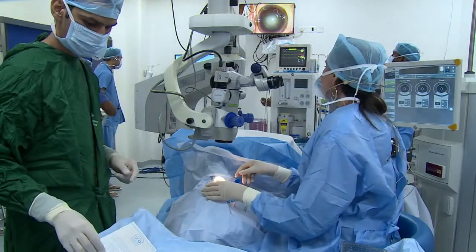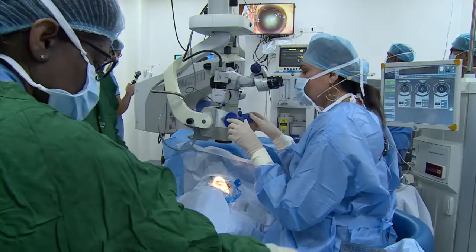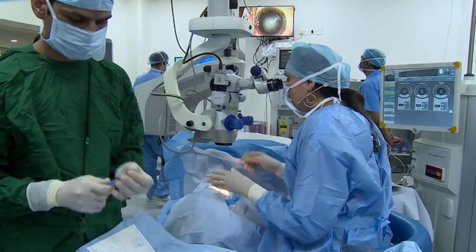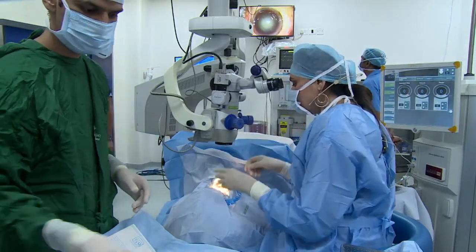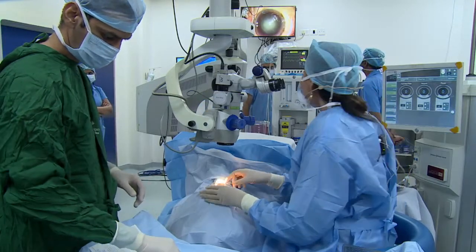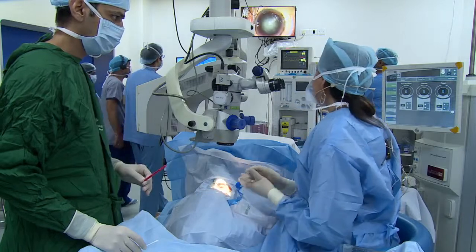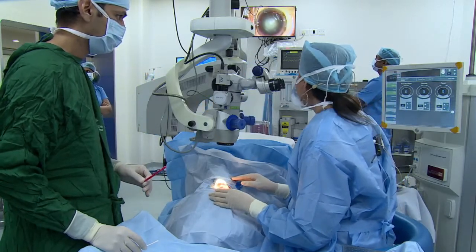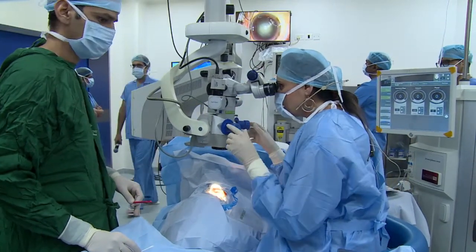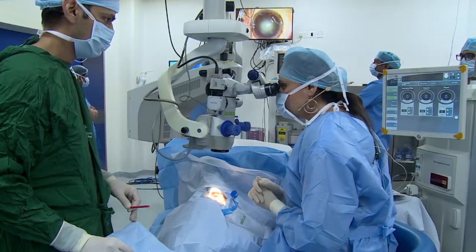Yes ma'am, good afternoon ma'am, can you hear me? Good afternoon everybody and welcome to this live surgery session relay from Center for Sight. Very excited to be in this world class state of the art OR facility. Missing Mahipa sir here. I would really like to thank the organizing committee of Delhi Ophthalmology Society, Professor Bhalla and Professor Rajendra Prasad, and Hoya Surgicals for giving me this wonderful opportunity to showcase a surgery in this live surgery session. I will be demonstrating a case of phacoemulsification with the implantation of the Hoya Vivinex Impress, the extended depth of focus enhanced monofocal from the Hoya company.